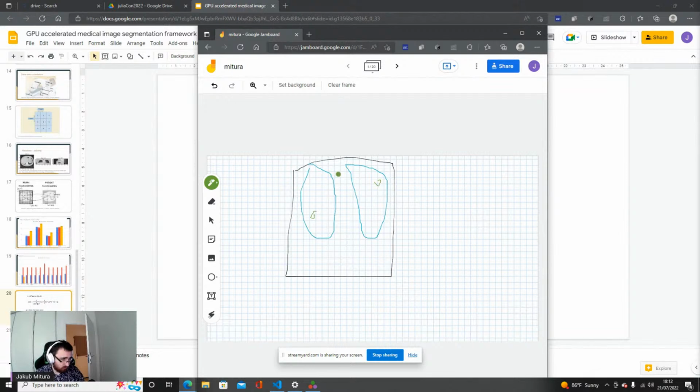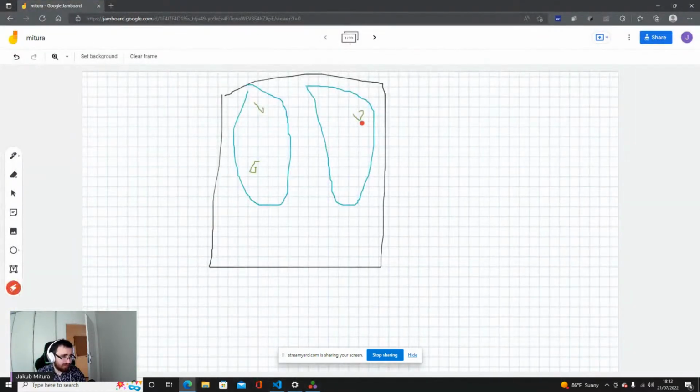It is very frequently the case that what we are looking for is very small. That's why when we are defining the metric that tells us how well our algorithm performed, we need to take into consideration that there is a huge misrepresentation.